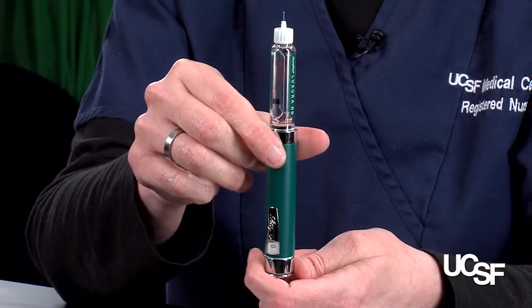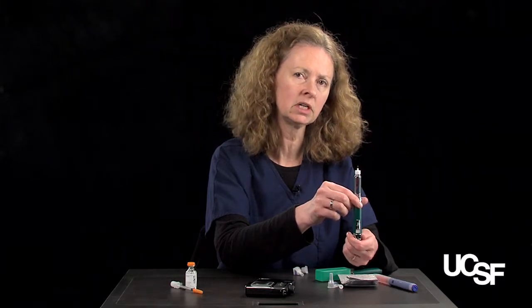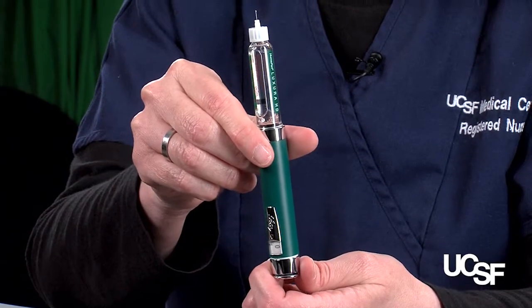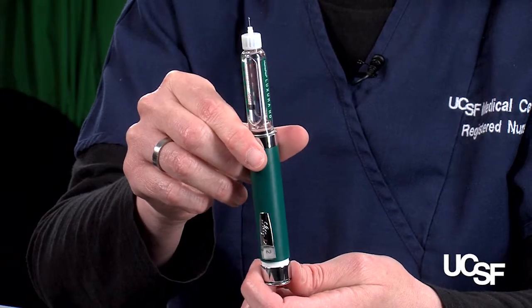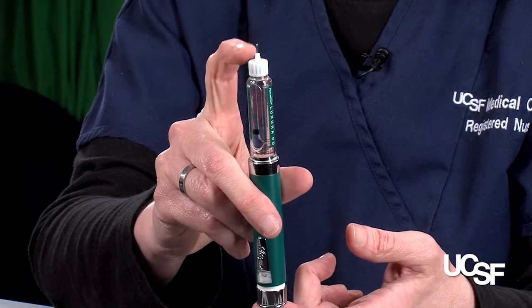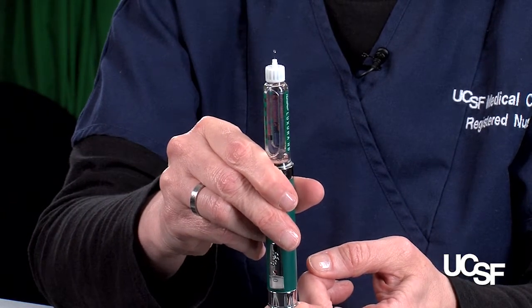Because it's a mechanical device, we teach the patients to do an air test before every dose to make sure that there is insulin flowing and that the insulin pen needle is primed. In order to dial the dose, I'm just going to dial on the bottom here a couple of units. Then with the pen upright, I'm going to push on the plunger end. I want to see some insulin coming out of that needle. So we teach our patients 3 drops.